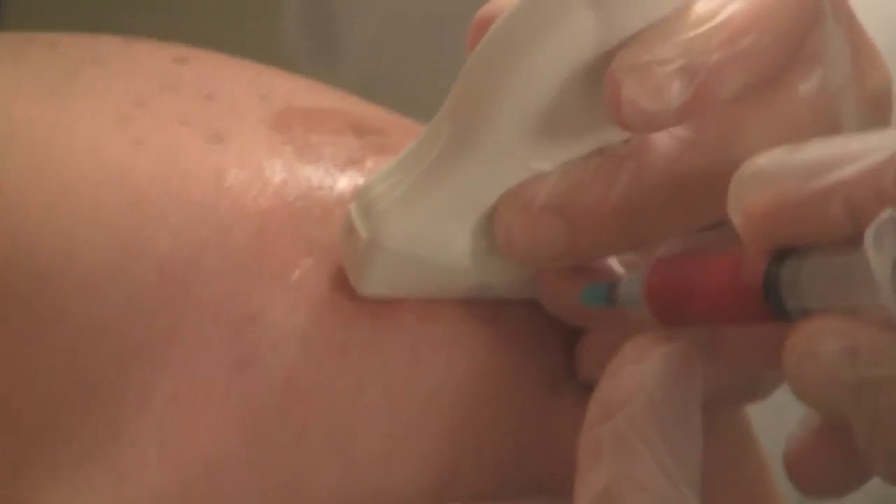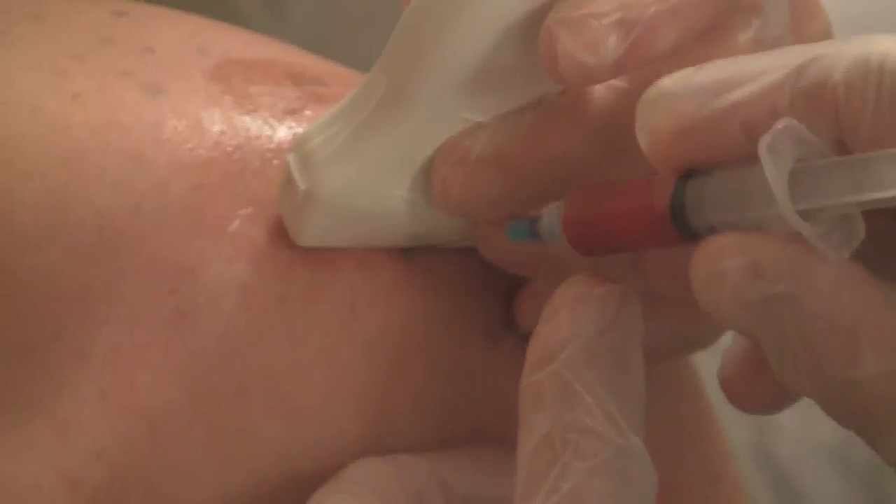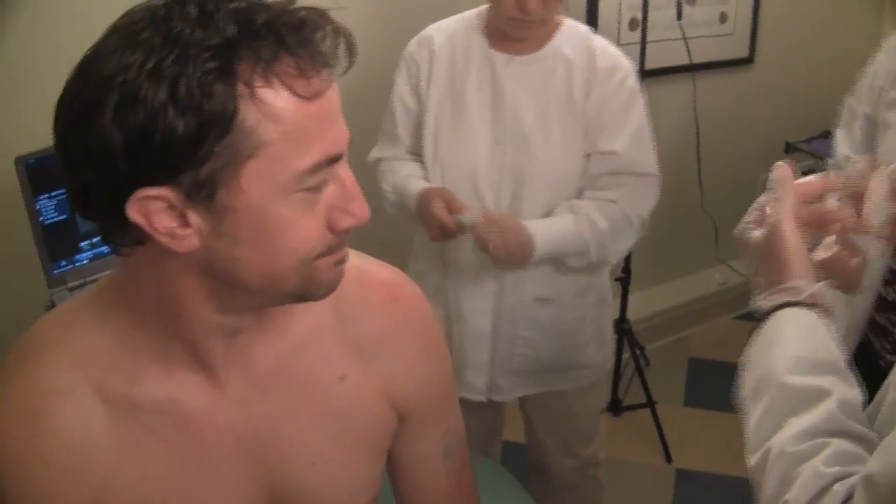My name is Mark Darrow. I'm a medical doctor. What you are about to see are procedures of PRP, platelet-rich plasma. The platelets contain growth factors and will stimulate the immune system to bring cells to the area that will actually grow back new tissue, stabilize the area, and eliminate pain.